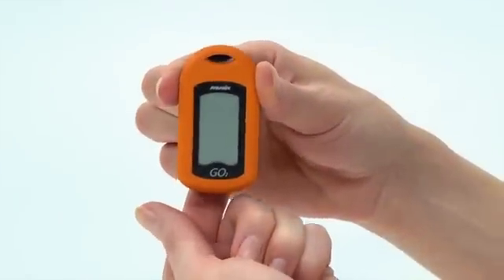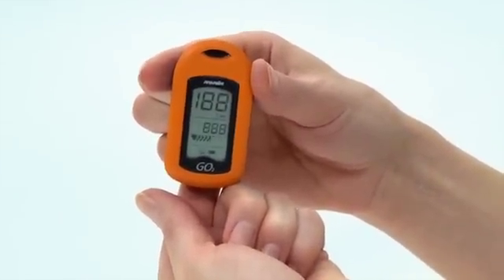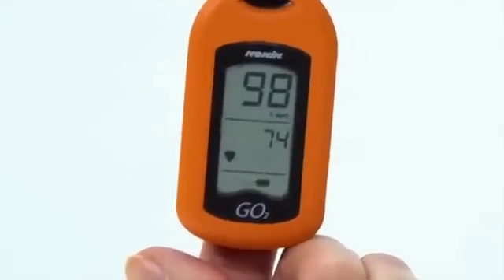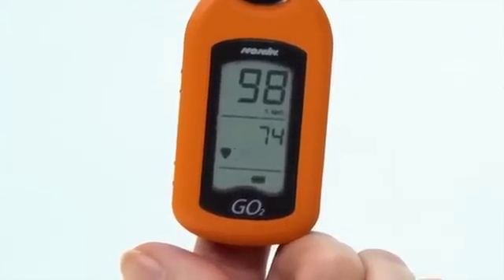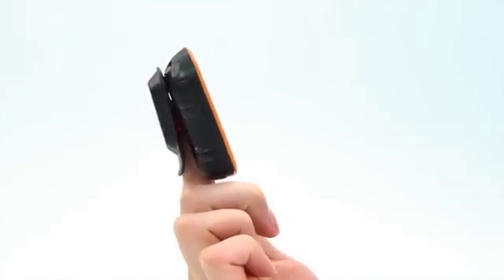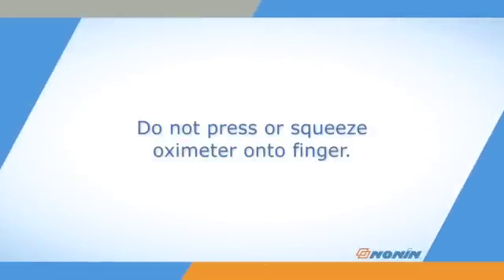To use the GO II Oximeter, just slide your finger into the opening until it touches the stop guide with your palm up and the display facing up for easy viewing. The Oximeter is hinged to gently hold the sensors on the top and bottom of your fingertip. Don't press down on the Oximeter or squeeze it onto your finger, as this may produce inaccurate results.